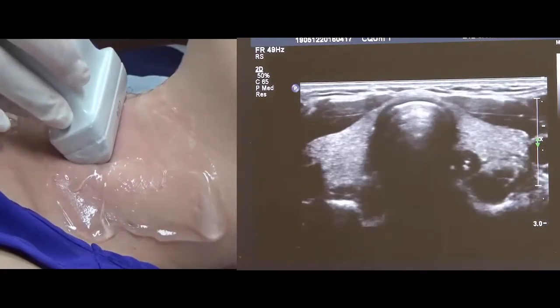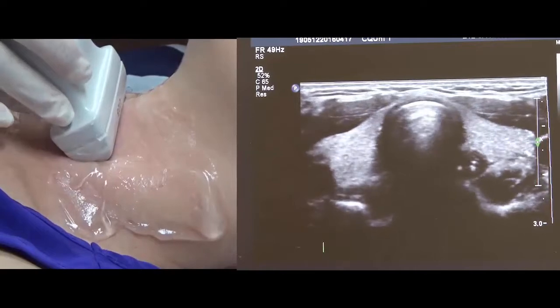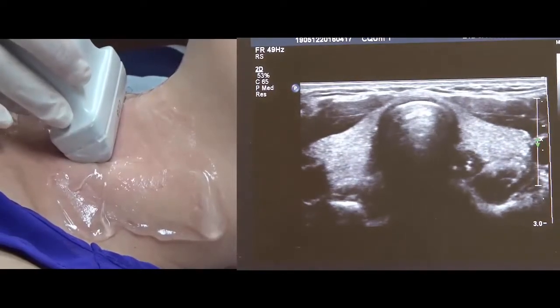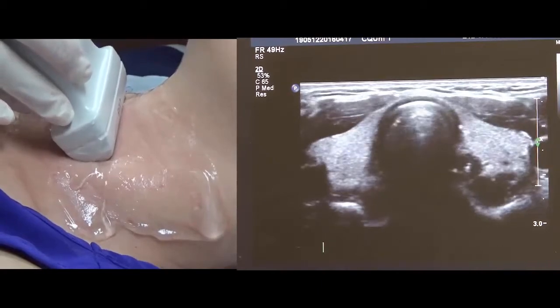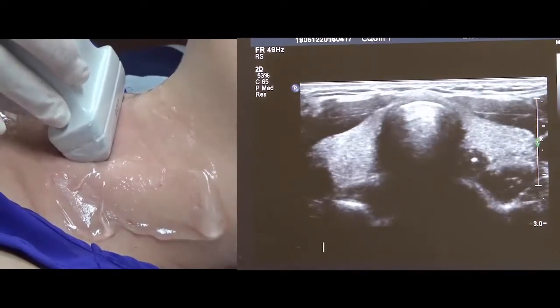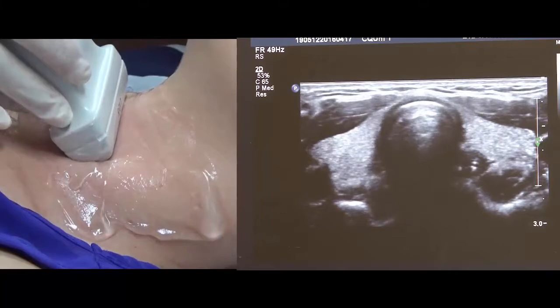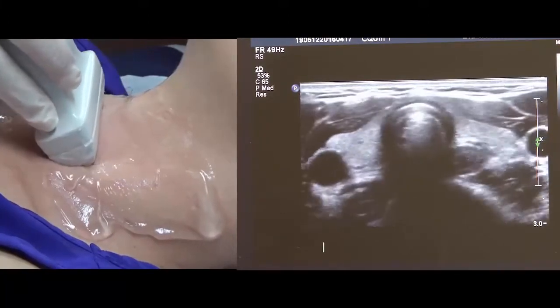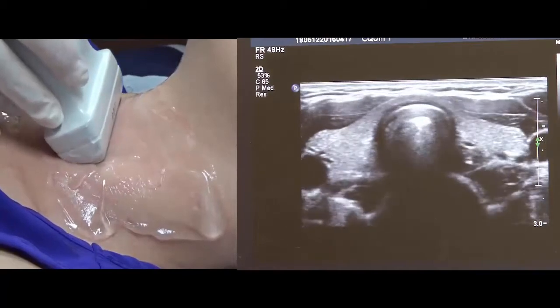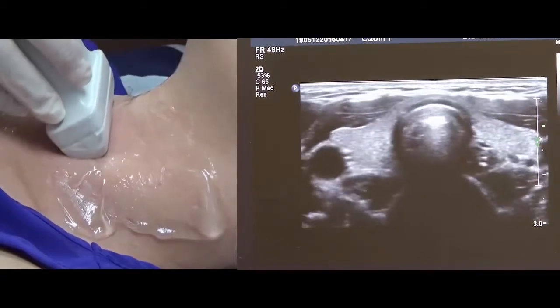If I've got loads and loads of nodules going on, I know I've got to take a bit more time because I'm going to have to take nodule images in 2 planes with 3 measurements. If I can see everything's perfectly fine, it's going to be a slightly quicker scan, so I might take a bit more time doing some vascular studies. So please make sure you're really planning ahead for your scanning.